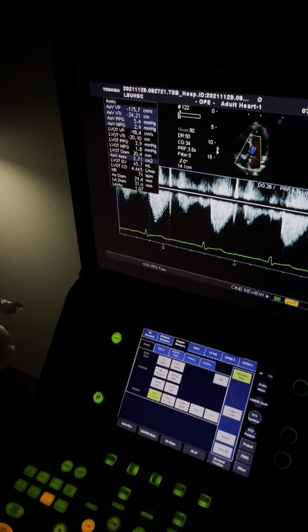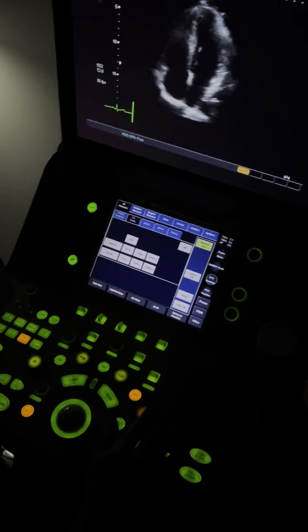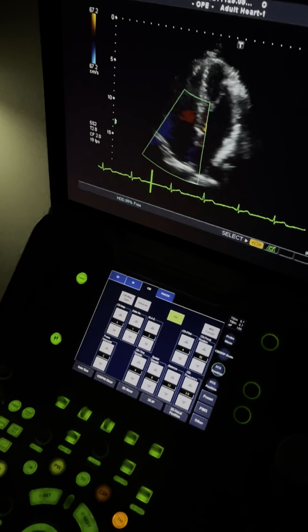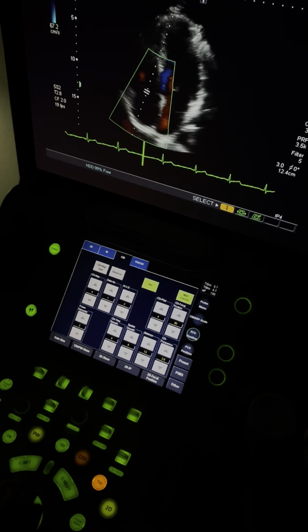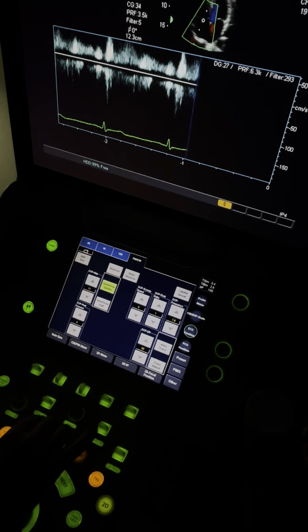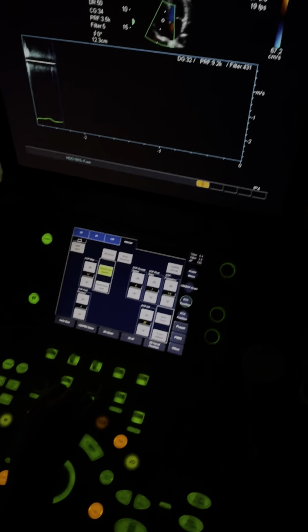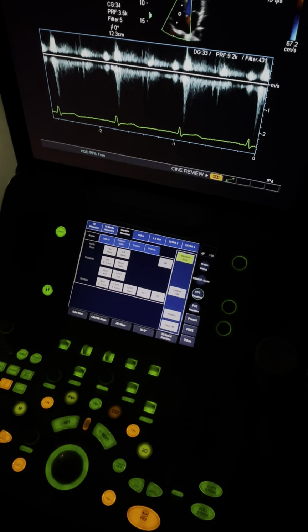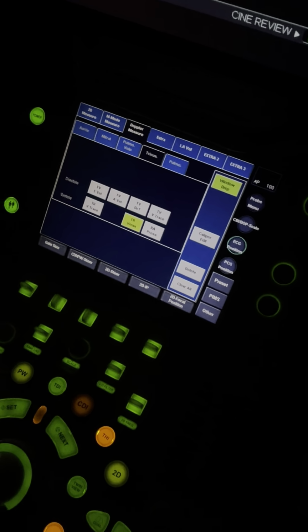So this tells me that my aortic valve area is 2.7, which is perfectly normal, which is a good thing, right? So now we're going to go over here to the right side. Turn on the color. See if we can find Paul's TR again. Call up my cursor. Put it through it. I'm going to use CW. Not really picking it up, but it's on the tricuspid page, TR Vmax. I'll pretend it's that. Okay. But that's really just a value.